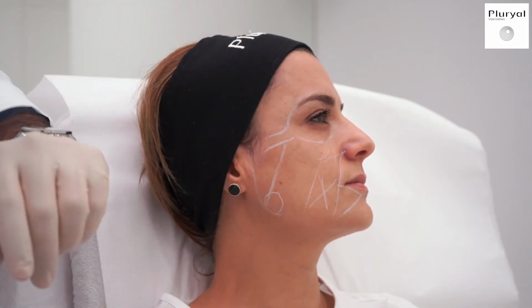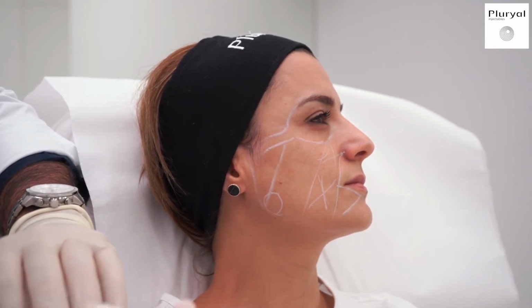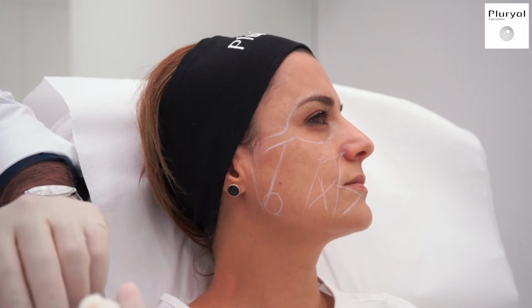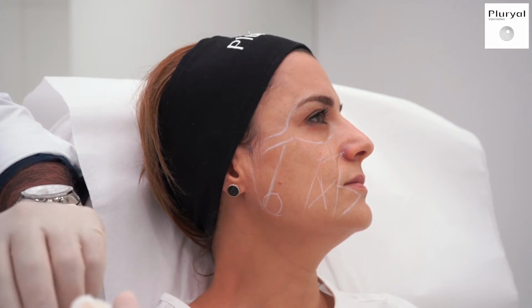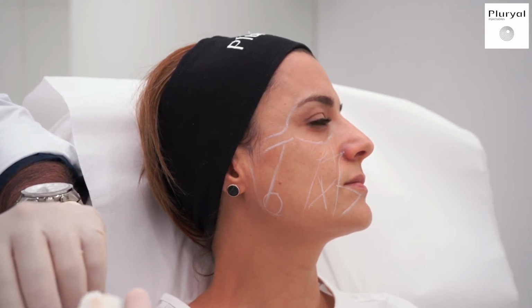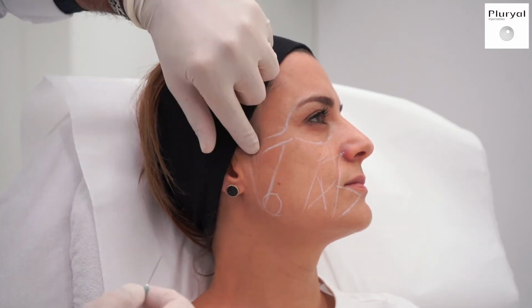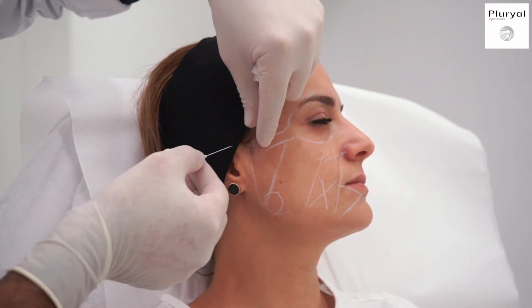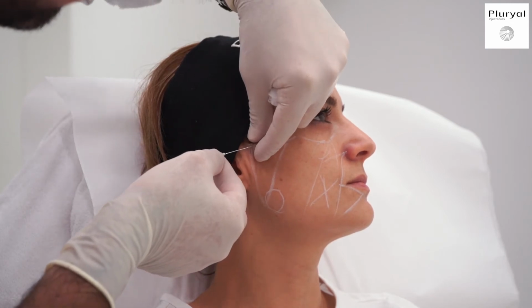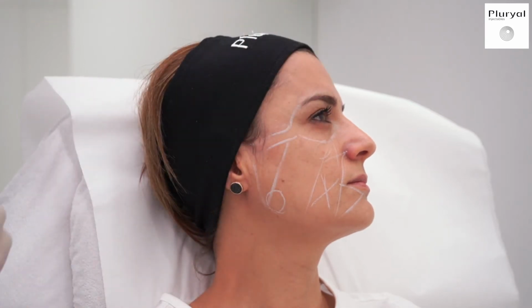Also here we have two techniques. We can use the needle or we can use the cannula. If you want to use the needle, it's better to use a thick filler like Contour Lidocaine. I will be using here Volume Lidocaine and use a cannula. You always touch the zygomatic arch. You don't have to go deep whenever you do the hole.